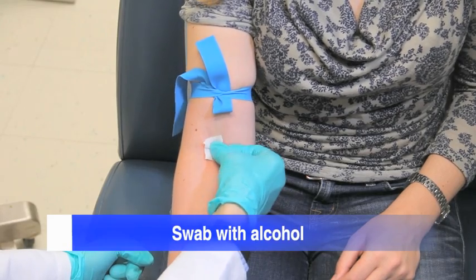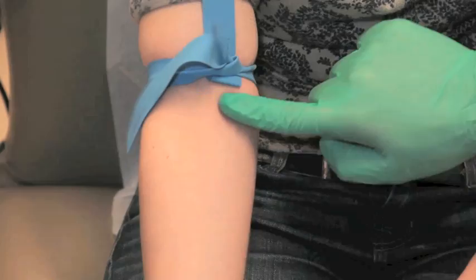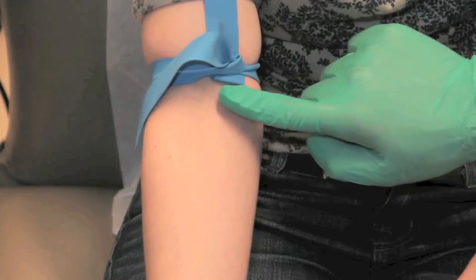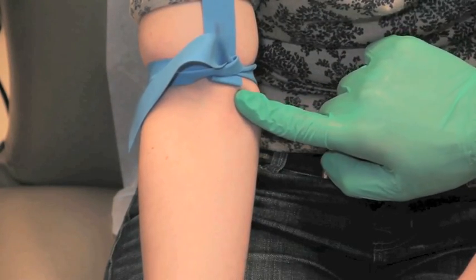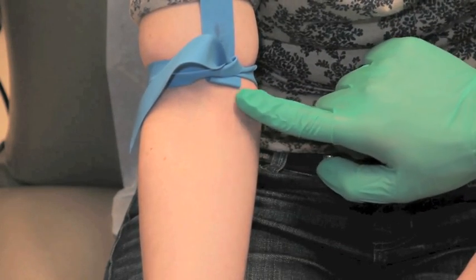Swab the area with an alcohol pad. Wipe until dirt is no longer seen. Next, feel the area for a vein by gently and rapidly pressing up and down along the equator of the antecubital fossa with your right index finger pad. You need not visualize the vein.